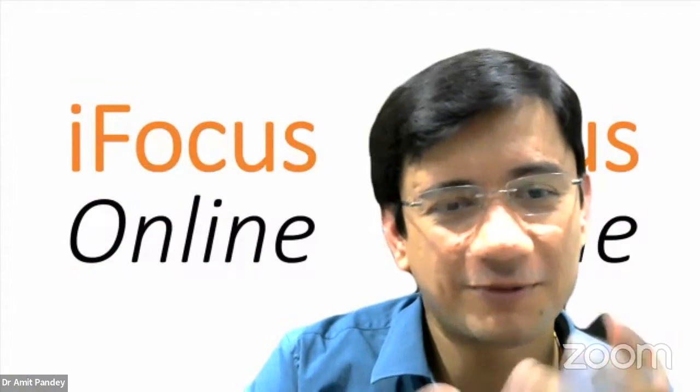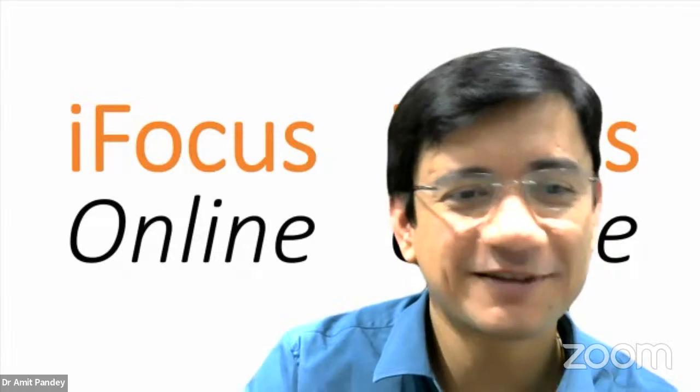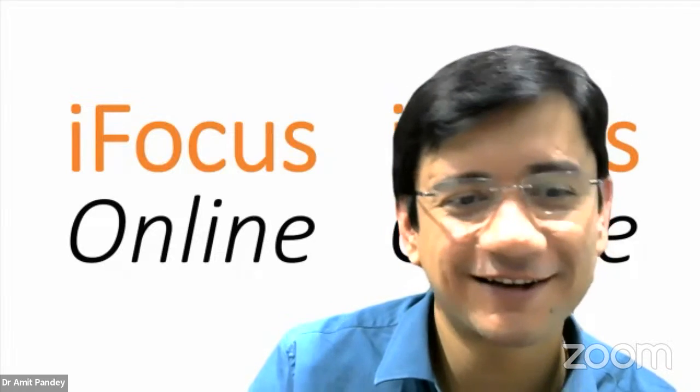So usually my SICS are the cases where I have decided that the nucleus is very super hard and the endothelium is not that good. In the first case only, if you're doing an SICS, that means that you're not able to do a phaco in that case, right? Yeah, that's why you are doing the SICS.